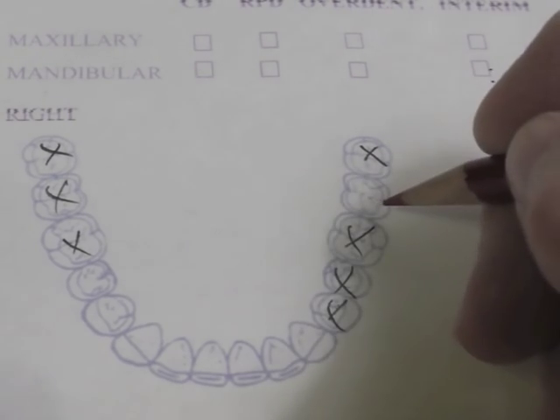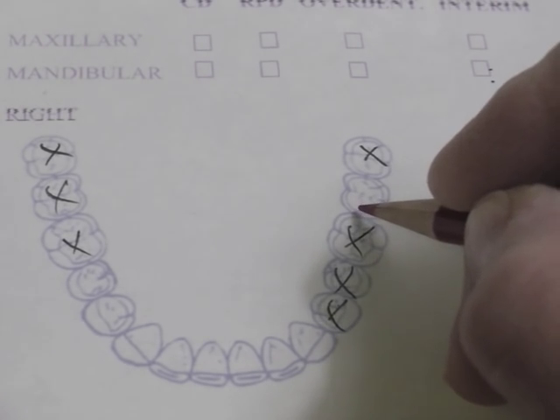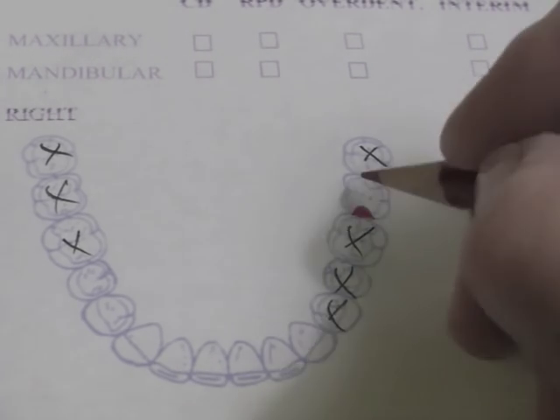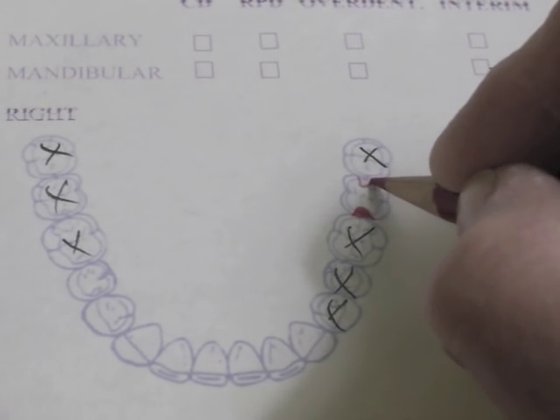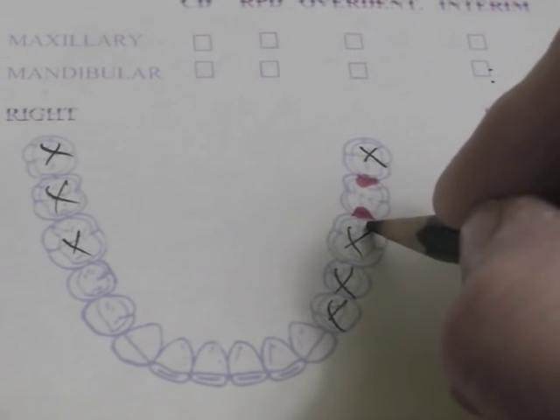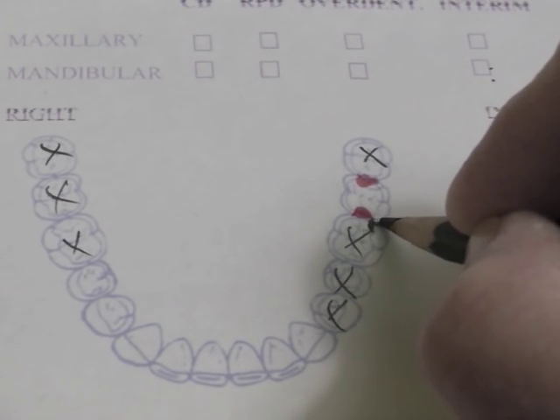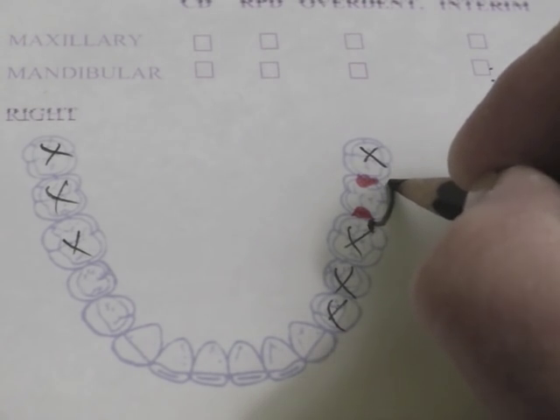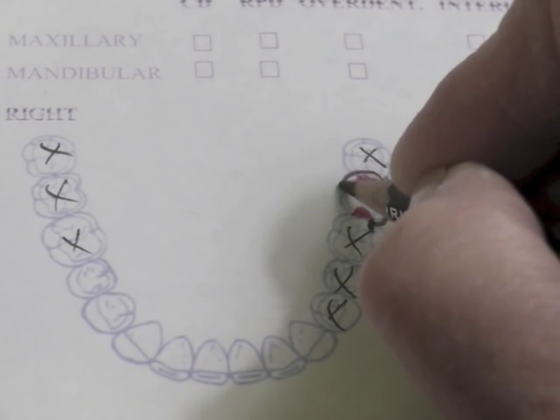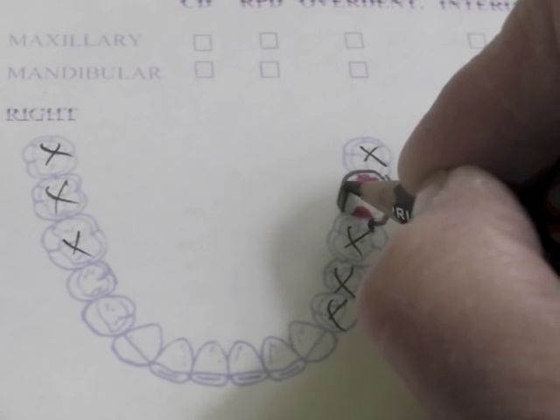Then I like to start by drawing my direct retainers. On the second molar, we decided that we would do a ring clasp. We're going to need to have a mesial rest and a distal rest on a ring clasp. So we're going to have a little guide plate coming up here, and the guide plate will end at the bottom of the cast circumferential — that is the ring clasp. It'll go all the way around here.